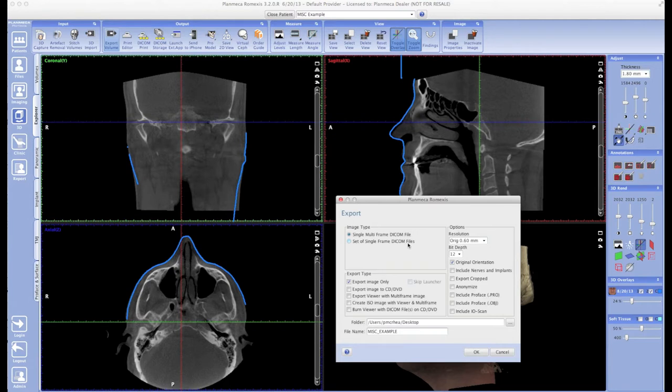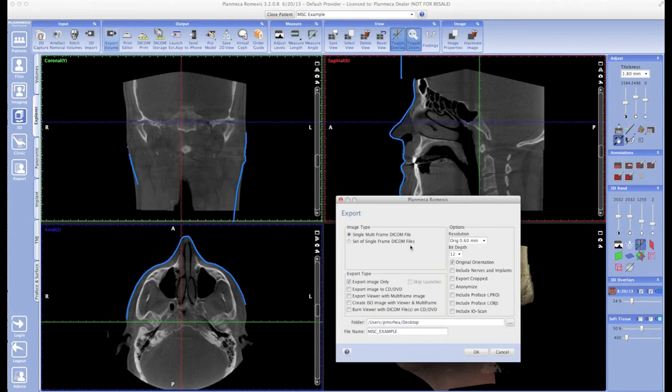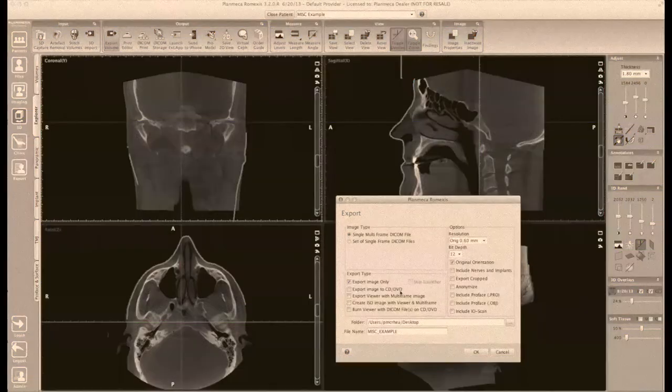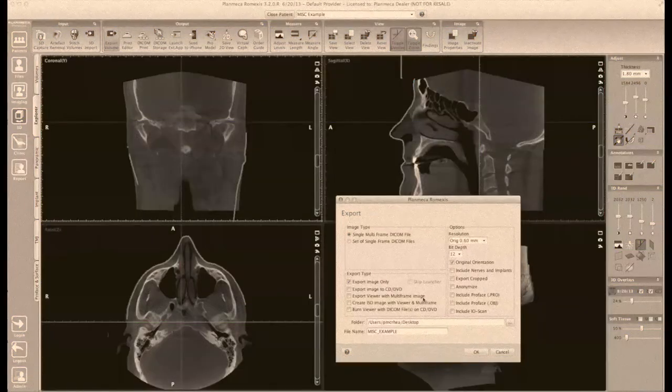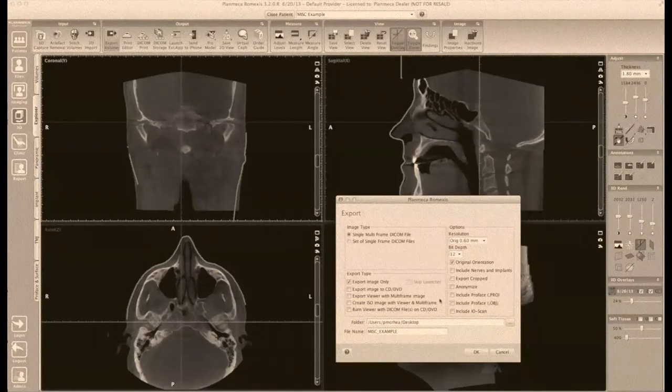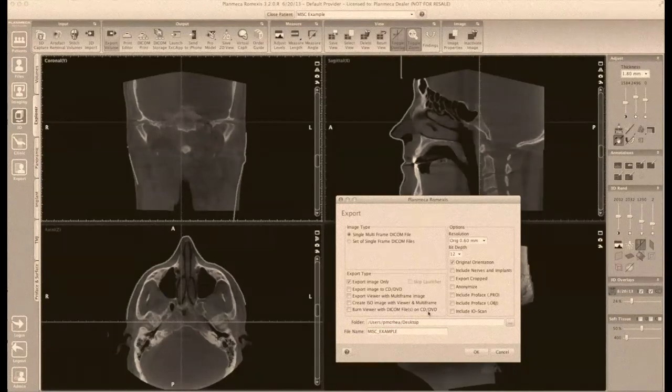What I would do is stick with a Single Multi-Frame DICOM File. Now, all the checkbox options on this window are self-explanatory, so what I'm going to do is show you how to burn a disk with a viewer or make a thumb drive with a viewer that you can give to patients or colleagues, and that they can actually use to open up that 3D data set and rotate it around and look at it just like you can in the office.